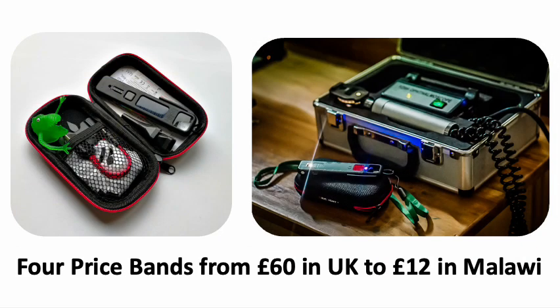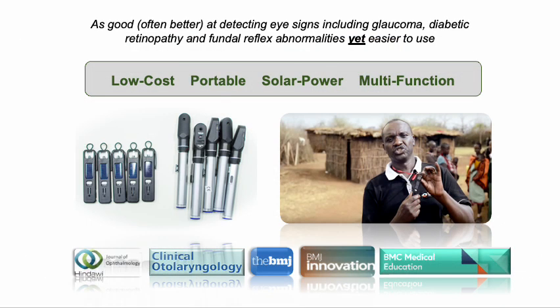There are 4 price bands depending on the Human Development Index of a country, with a cost of £60 in those with the highest HDI and £12 in the lowest. Despite its low cost, small size and simplified design, many studies have now been published supporting its role as an effective replacement for much more expensive traditional tools, particularly in performing the fundal red reflex test.